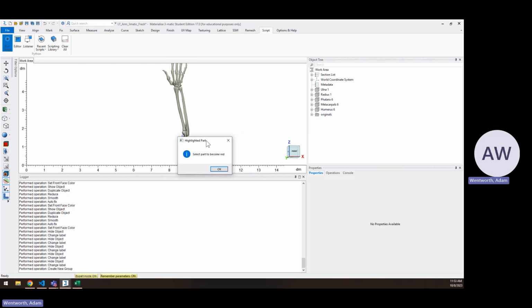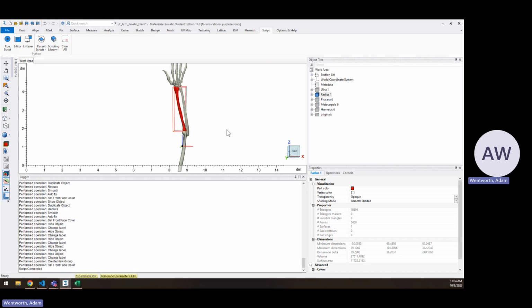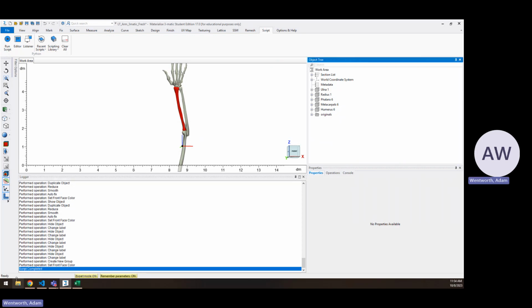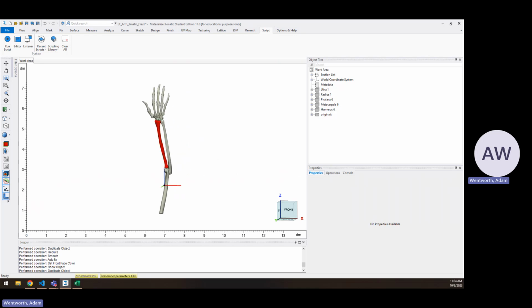So here we have a pop-up, which you can see has allowed me to click on a bunch of stuff, and we can even run functions right now separately. But that creates kind of a pause in the script, and if we select any part, it will return that part and make it red with this part of the script. So we just did the radius bone, made that red, and then also typed out script completed, indicating that the script is finished running. So yeah, essentially we've shown some basic functions that can be done with scripting.